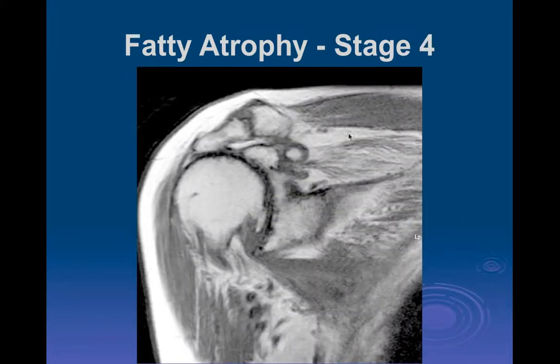Here's stage four—almost complete replacement of the supraspinatus muscle with fat. There's a tear with proximal retraction, superior migration of the humeral head, a lot of eburnation and marginal osteophytes, complete denudation of the articular cartilage with eburnation and subchondral cysts. This is really more of an end-stage shoulder.